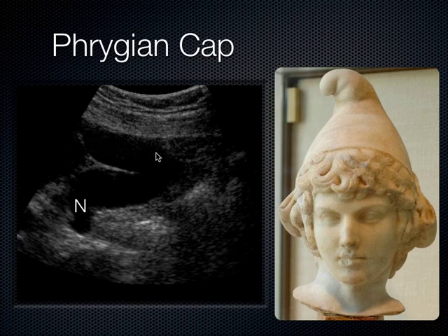And so sometimes you follow these gallbladders throughout all their folds. Just keep in mind that the concept of a gallbladder that's septated is almost impossible. In fact, I've never even seen one. People call me, hey, we have a septated gallbladder. I go in there, and if I can just fan through enough, I'll find where it's confluent with the rest of itself, because it's just a fold.